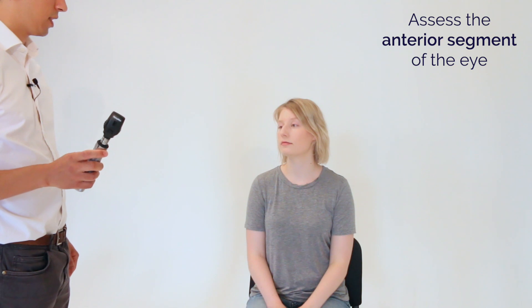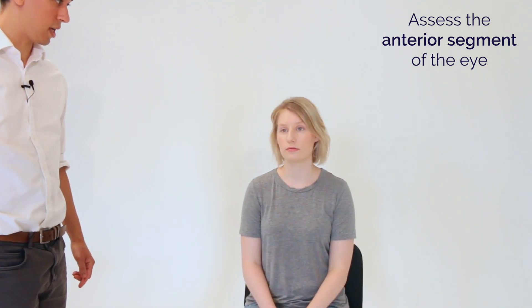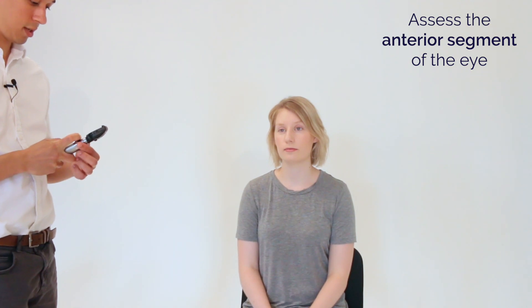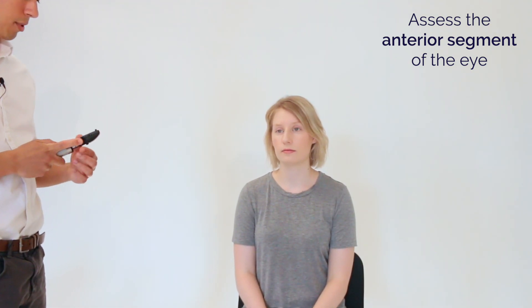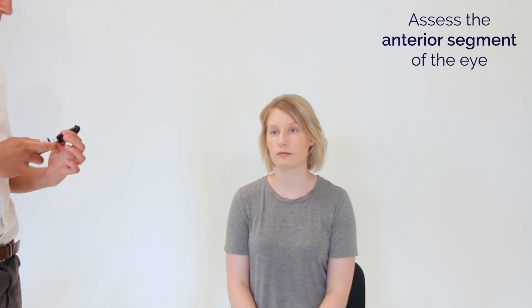Okay great, so I'm going to have a closer look at your eyes now with this machine here. If you could have a look for me in the distance over there, perhaps at the light switch. I'm going to come closer and there's going to be a bright light. I'll pop a hand on your shoulder so that we don't bump into each other.